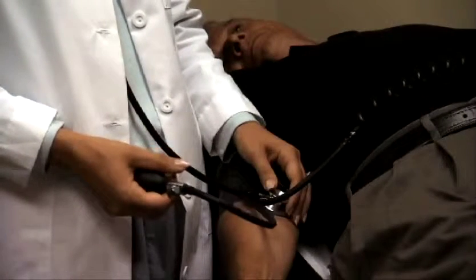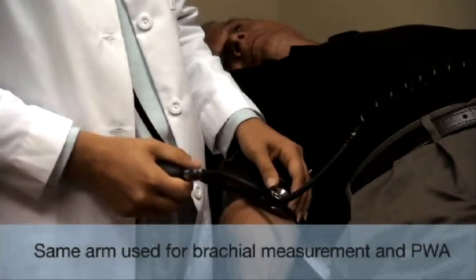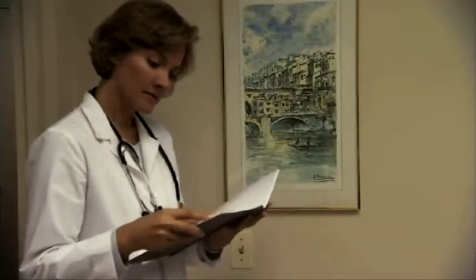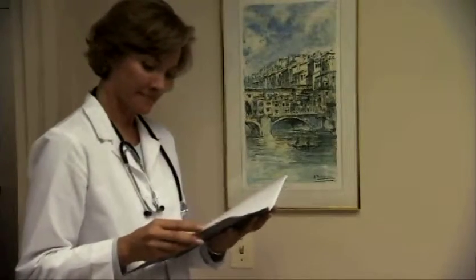Take the subject's brachial blood pressure. As always, strict compliance with procedure is vital in assuring accurate brachial blood pressure measurement. Review the study protocol to determine which arm should be used for brachial blood pressure measurement and pulse wave analysis.